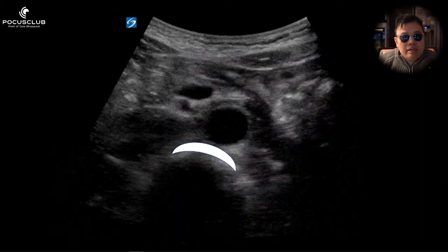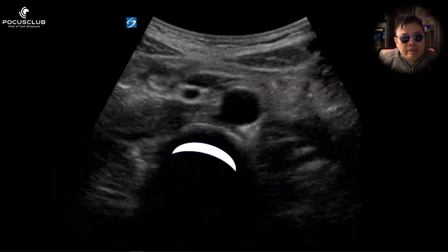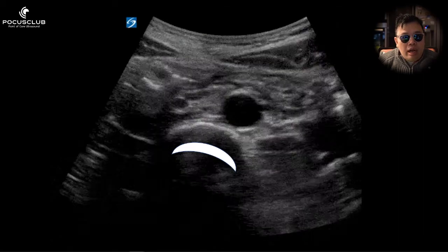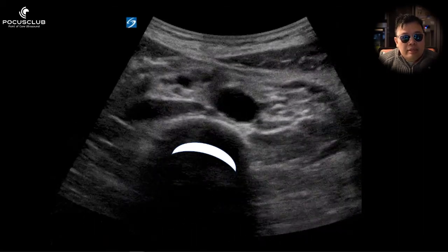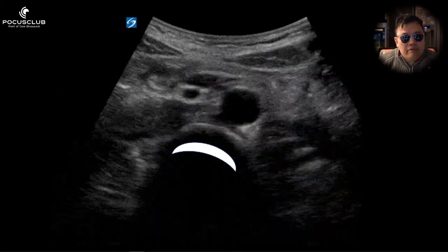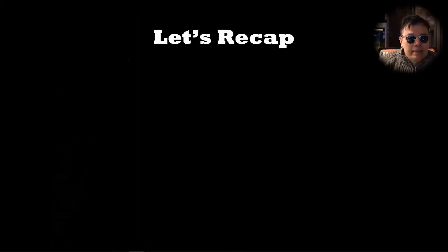The aorta is very closely associated with this. Look how anterior the aorta is. Look how clearly you can visualize this.